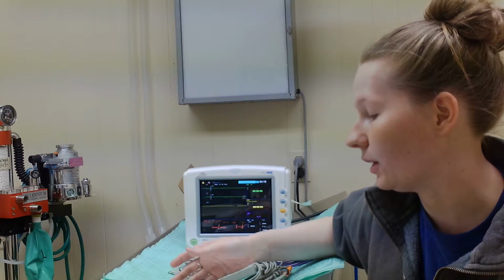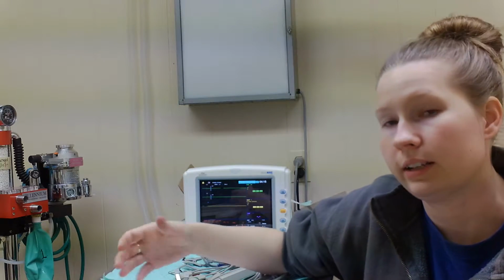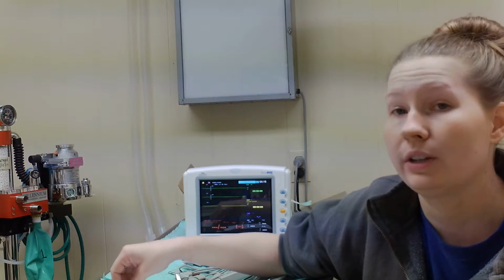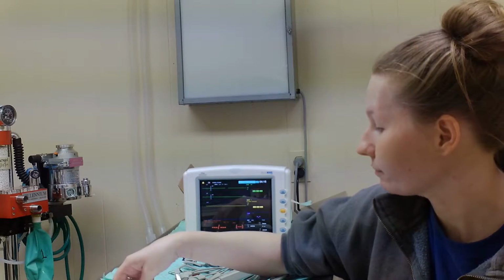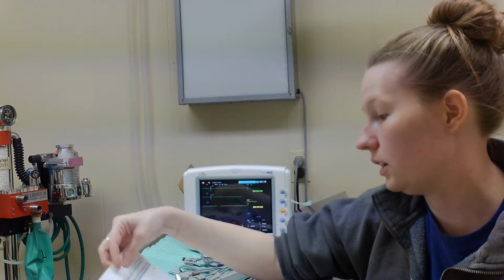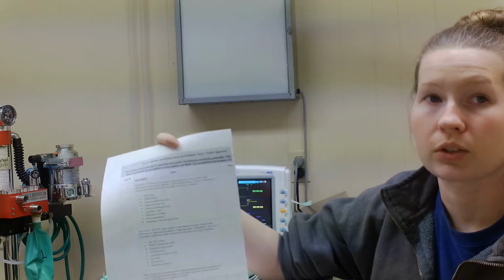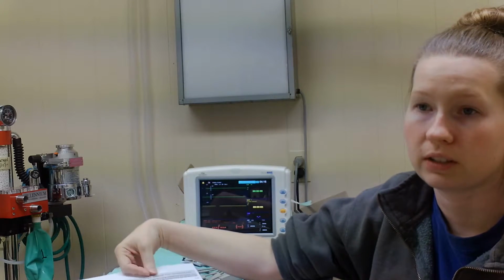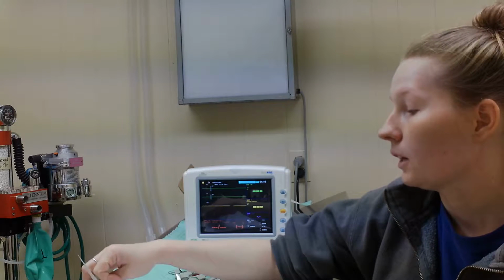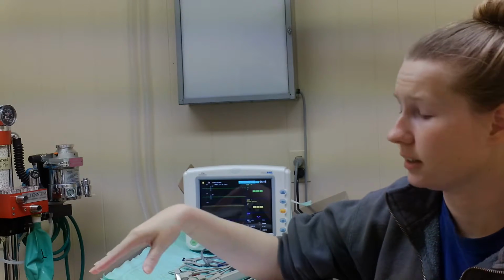It's important to know what the heart rate is because it gives you an idea of what their anesthetic plan is if they're going to be under anesthesia. Plus, obviously, the big no-brainer is that they're alive. That's why it's important to know the normal heart rate for regular dogs and cats, even if they're awake and non-anesthetized. Obviously, if they're in too deep with anesthesia, their heart rate is going to decrease. I'll get to that in a minute.